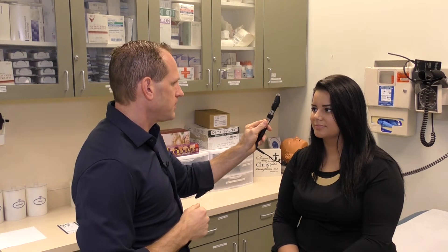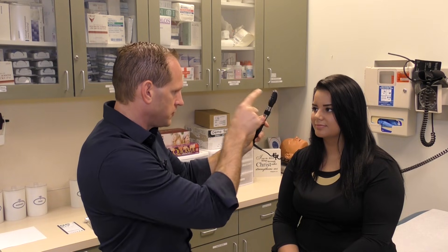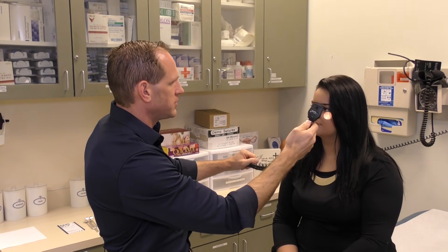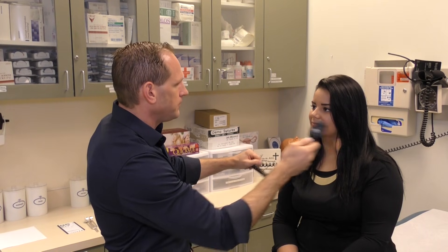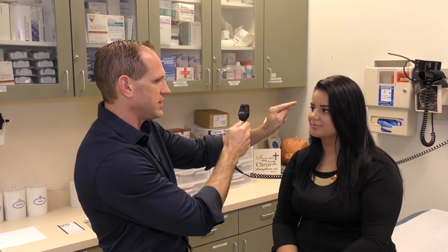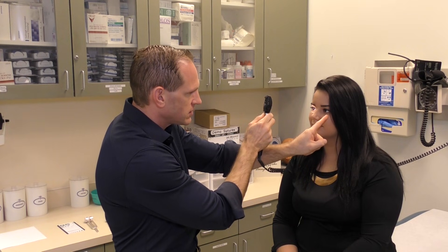Come a little closer and shine the light on one eye — you're looking for the pupillary response; you want to see the pupil constrict. Dark brown eyes will be harder to see than blue eyes. When you shine the light in the right eye and that right eye constricts, that's called direct constriction. When you shine the light on one eye and the other eye constricts, that's called consensual constriction, and that's what you want to see.